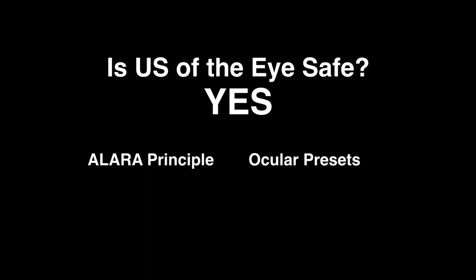To help ensure this, you always want to use the ocular presets, one to ensure safety, but also to make sure you have the right settings to view the eye as best as possible. To this date, there is no data to support any danger to the eye with eye ultrasound. However, again, we just have to be cognizant that we want to be as safe as we can for the patient.